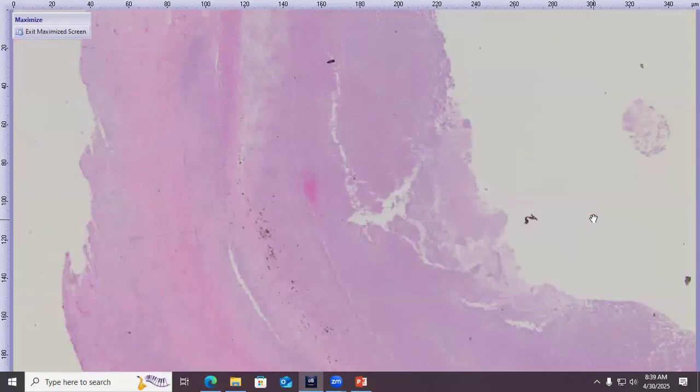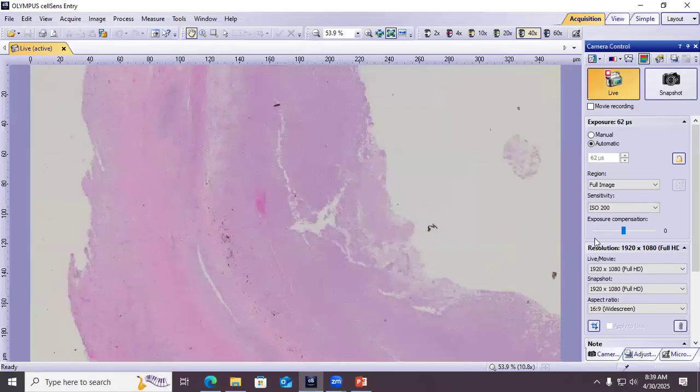So I lost money on that one. It looked like a very solid mass. It does. It was a mass effect. Very gooey.